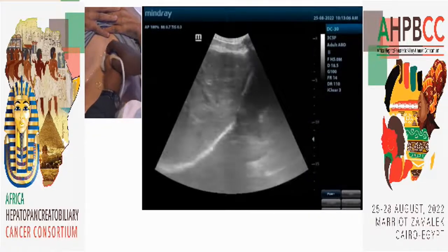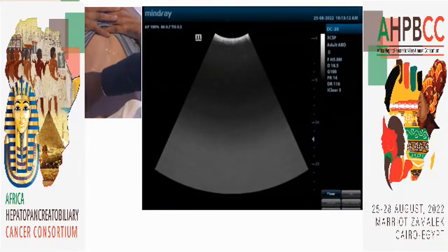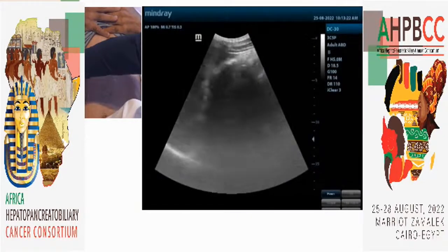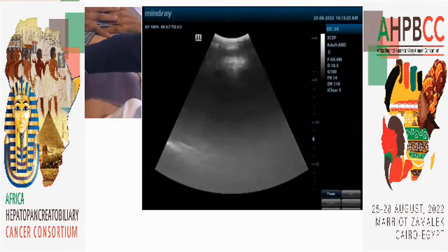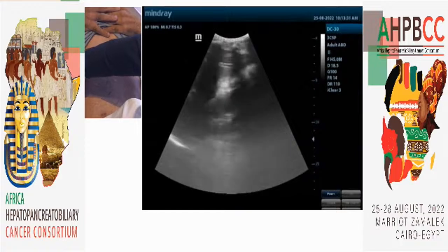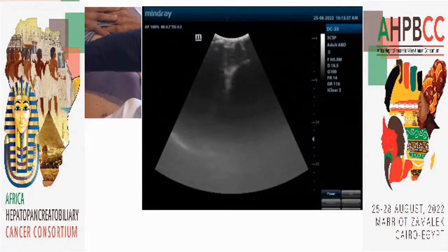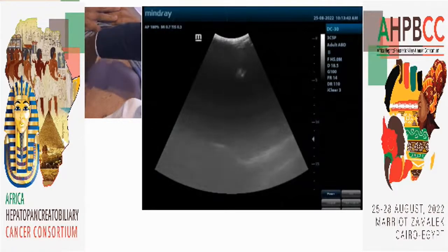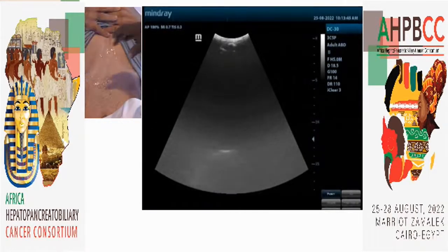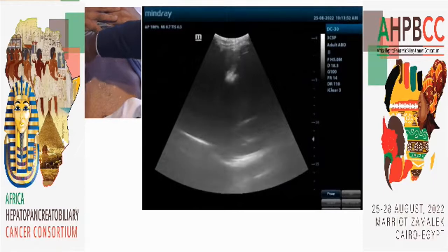But don't end here. Go to station 4. You come here, in intercostal. First of all, you go to the level where you would visualize the liver and the kidney together. You can measure the span of the liver in this view. And then you can also, at this stage, fan and move to the intercostal spaces from here, obliquely, parallel to the intercostal space, space by space.